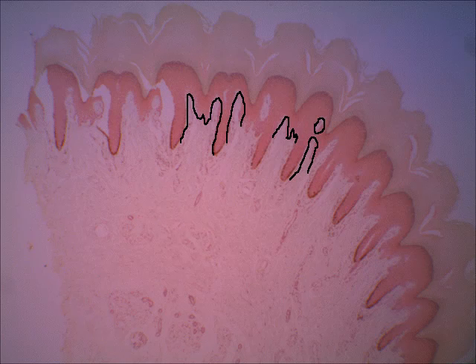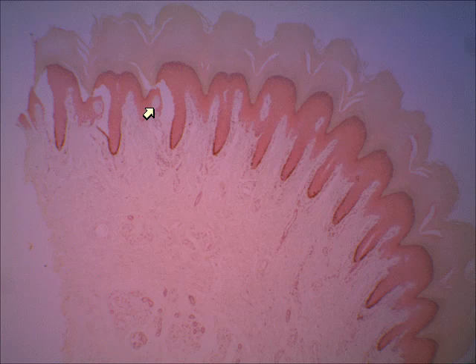Your Meissner's corpuscles, which are your touch or tactile receptors, are sensitive to very light touch and texture. They're located within the dermal papillae. I'm going to put an arrow on the Meissner's corpuscles. You don't see them in every one because of the way it's sectioned, and you're not going to have them in every area, but here I've got pointers on a few areas that have some Meissner's corpuscles.